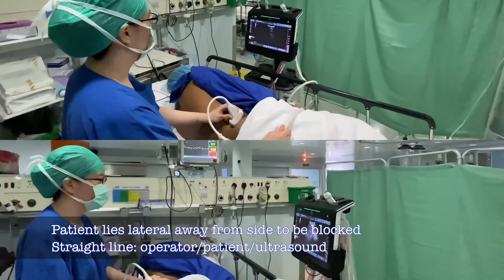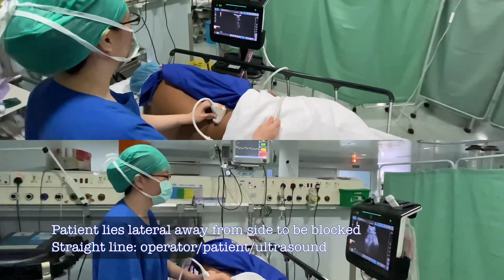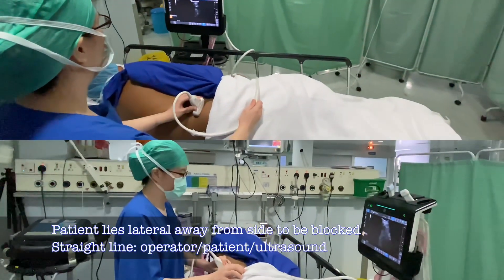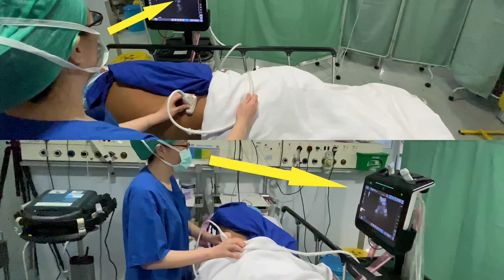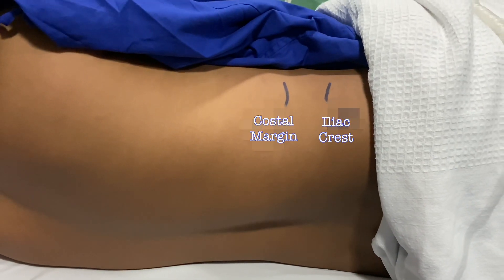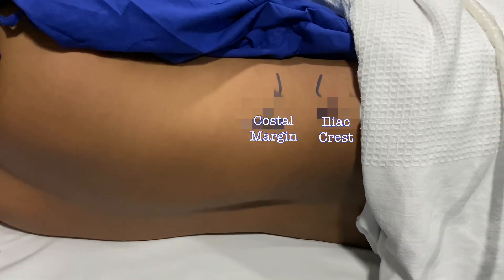The patient is placed in lateral decubitus position with the block side up. For this block, the perfect ergonomic would be both the patient and operator facing the ultrasound machine. A low frequency curvilinear ultrasound transducer is used.